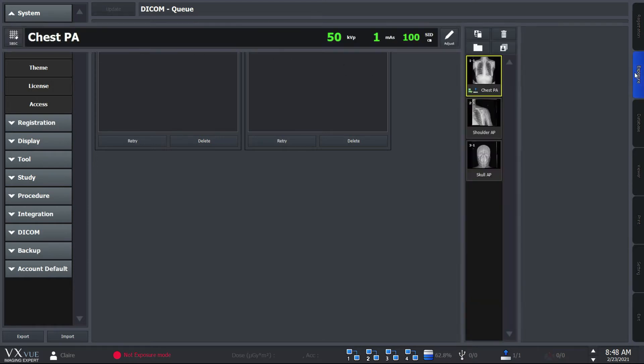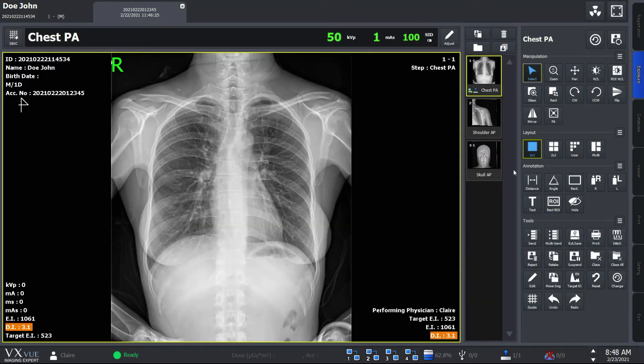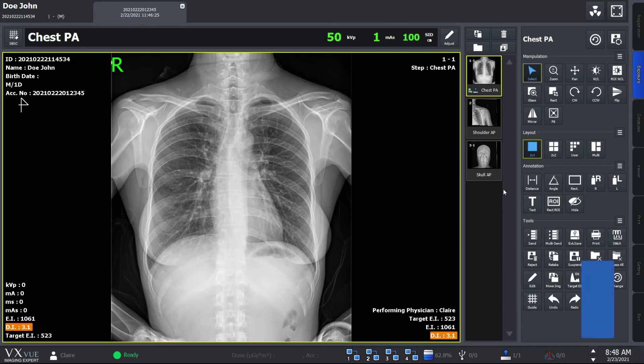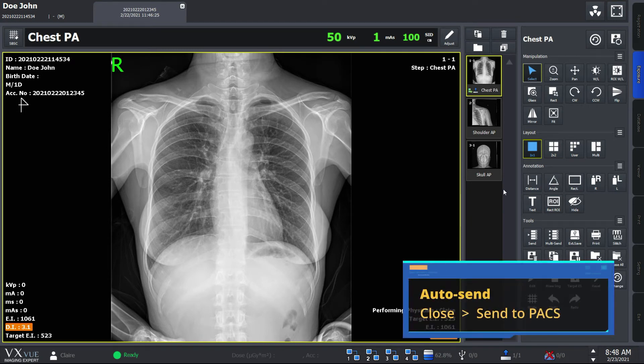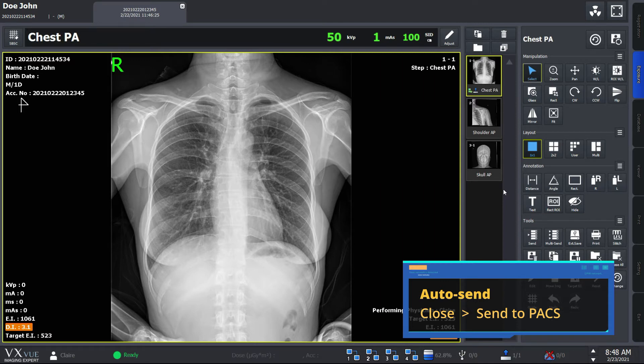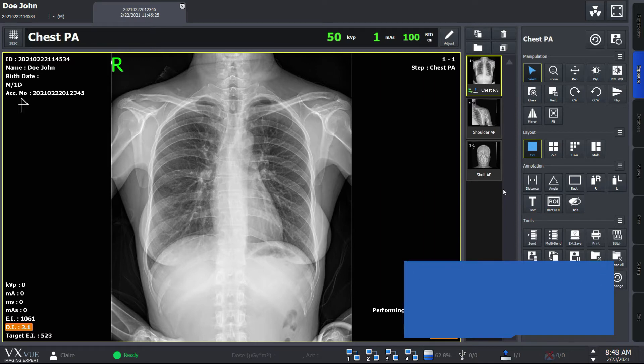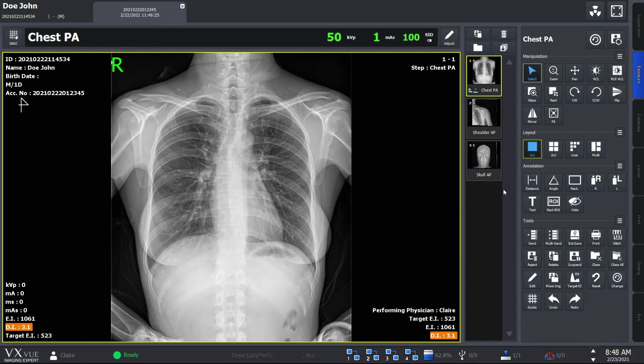For your information, to make the whole process more simplified, VXView offers AutoSend function. AutoSend function automatically sends the image to PACS when you close the image.